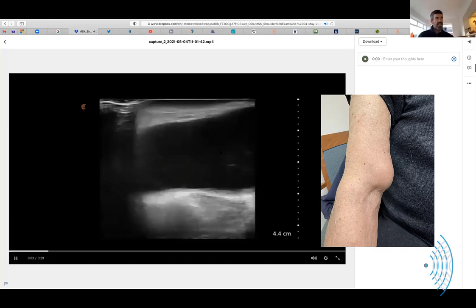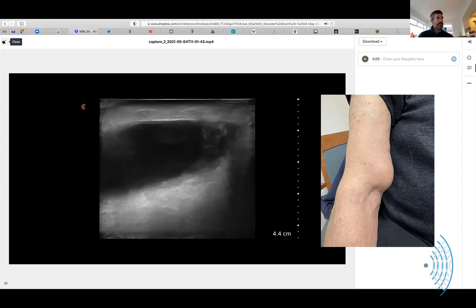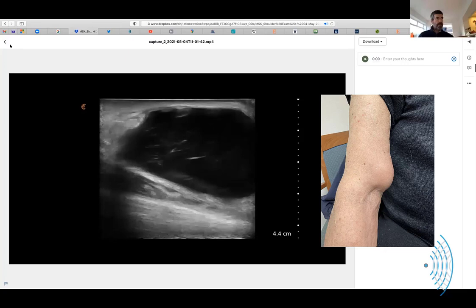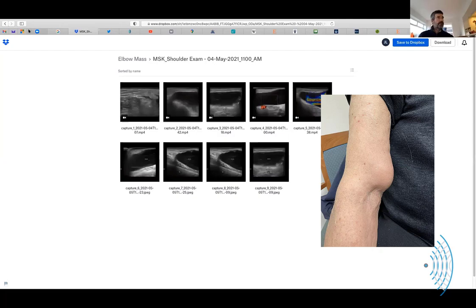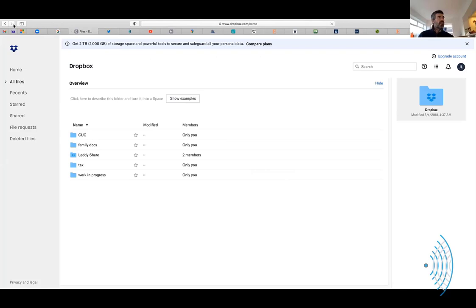Yes. Yeah. So let me tell you what I think I saw in the echoes up north, or above that proximal. I think I saw the long head of the biceps atrophied and the short head still intact. It was different than what I would normally have seen before. And could this have been a long head tear, and it was the accumulation of the blood product from the tear?